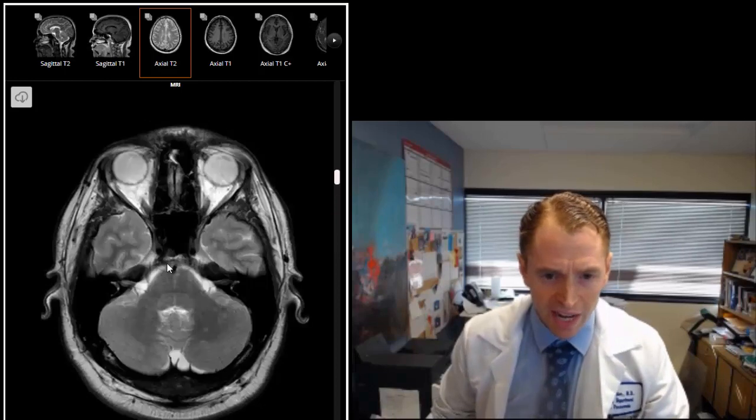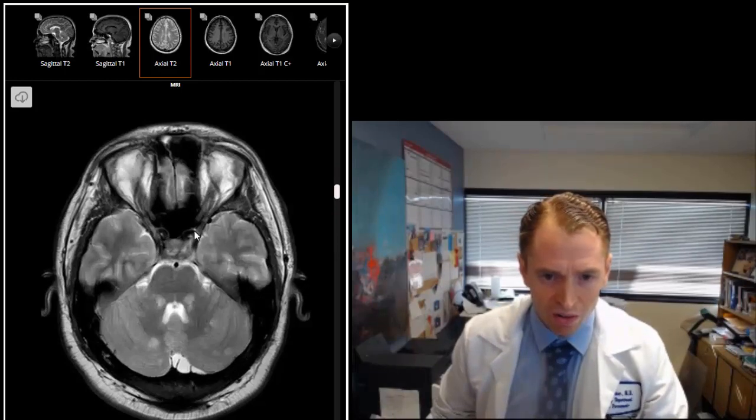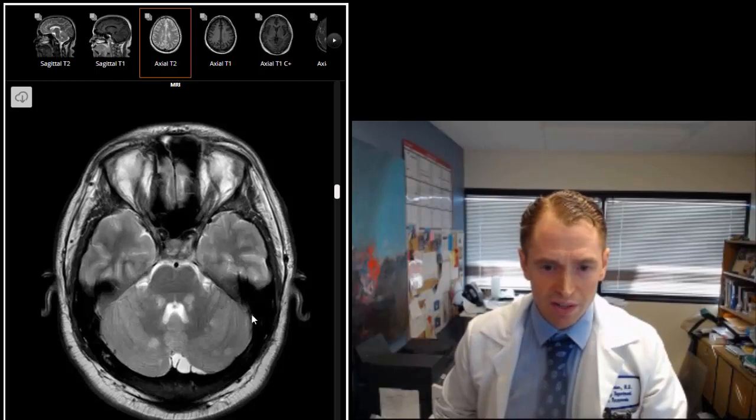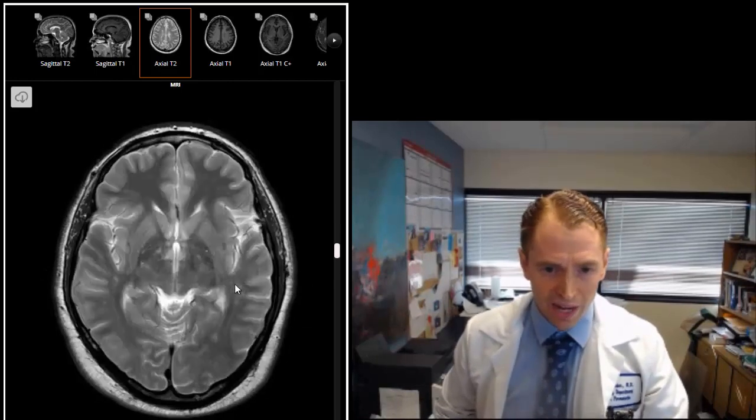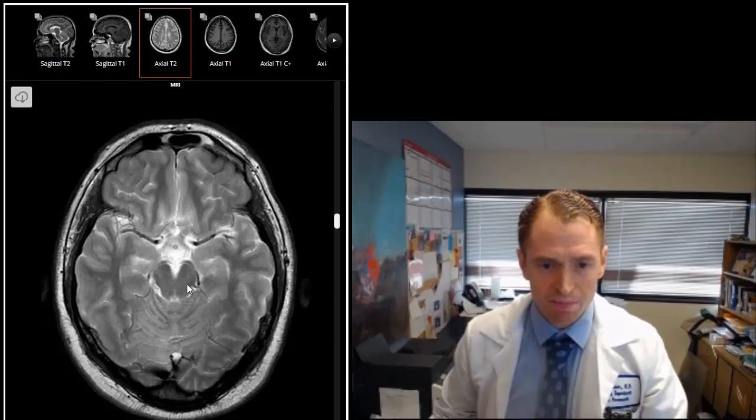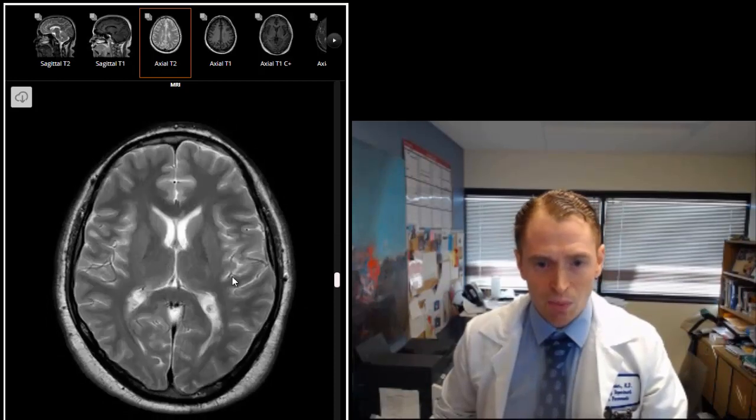Just to point out a little bit of anatomy: these are the internal carotid arteries coming into the brain, this is the pituitary gland, this is the basilar artery. If you look at it you can see these are the optic nerves and the optic chiasm and the optic tracts. These are the middle cerebral arteries for instance. This is the midbrain, these are the posterior cerebral arteries.